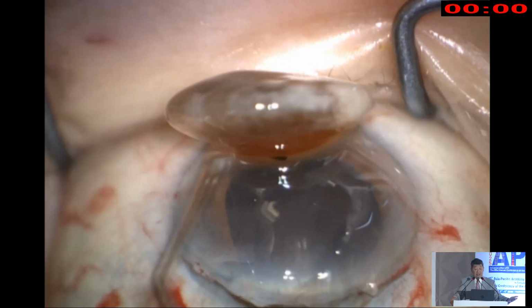Okay, look at that lens. You don't see the lens when you phaco it because you dissect it apart. But notice there's some viscoelastic on the top, but the top is flat, like a table. And the bottom is concave, like a rice bowl or a soup bowl. So this is kind of interesting. Thank goodness the front is flat. That's how we can complete a rhexis. It would be hard if it was upside down. And it tells you why it's so hard to chop through that and why it's so hard to crack when you do divide and conquer, all right?